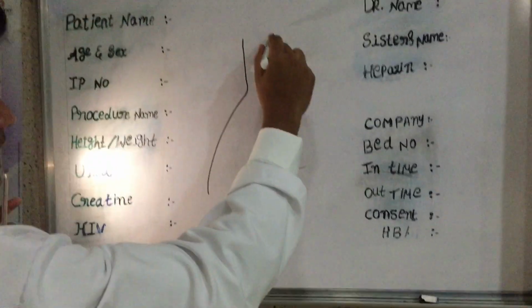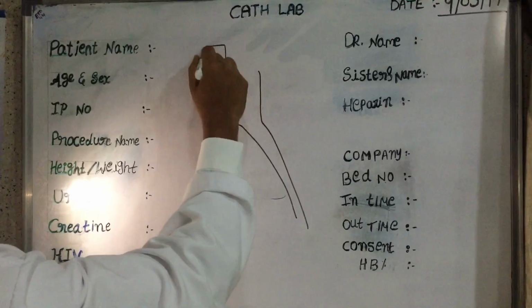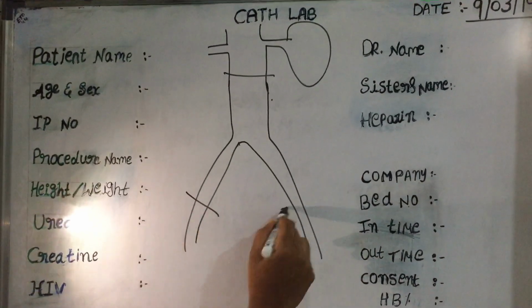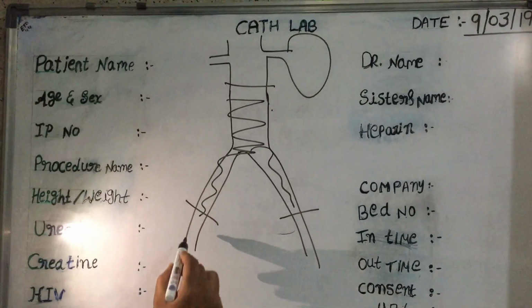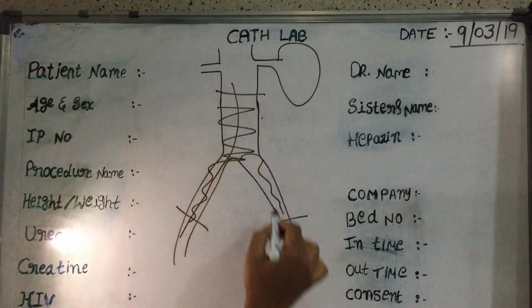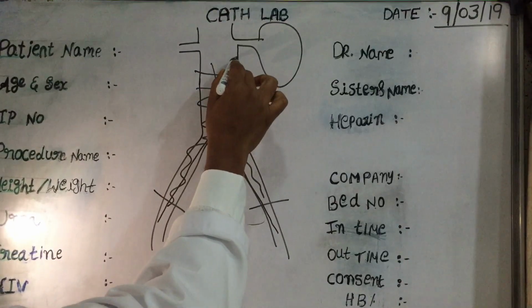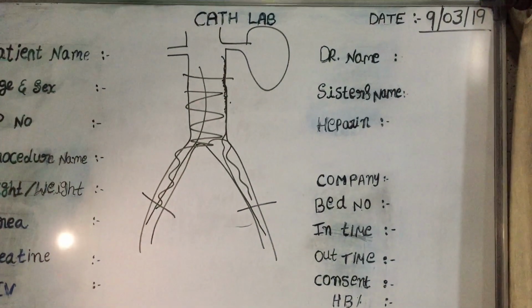The lesion here is the aorta and the bi-iliac occlusion, and this is the kidney over here. So let's say this segment is occluded. Whenever we try to pass the wire from this to this, we often get subintimal, and we go into the wall and go up. So we will never be able to come into the luminal segment.